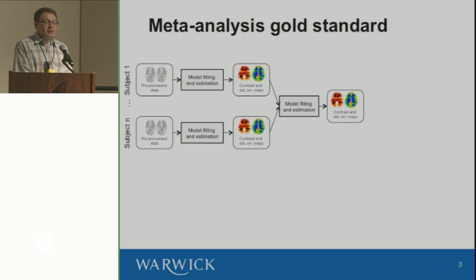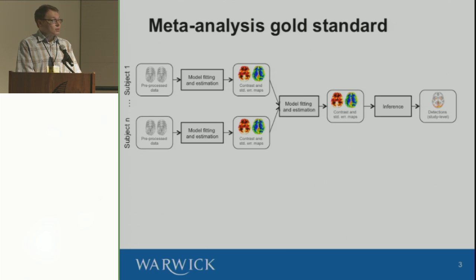And so the optimal way to combine information across subjects is not just by using their contrast, but by using their contrast and their standard errors. This is what FEAT's FLAME analysis does, and SPM also has an MFX option that's now available. It was always hidden there, but it's now usable. So this notion of combining information across subjects is something we're quite comfortable with and is routinely done, and the best way to do that is by combining both the estimates and their uncertainty together to get an inference. And then of course we get an inference on that at the end.